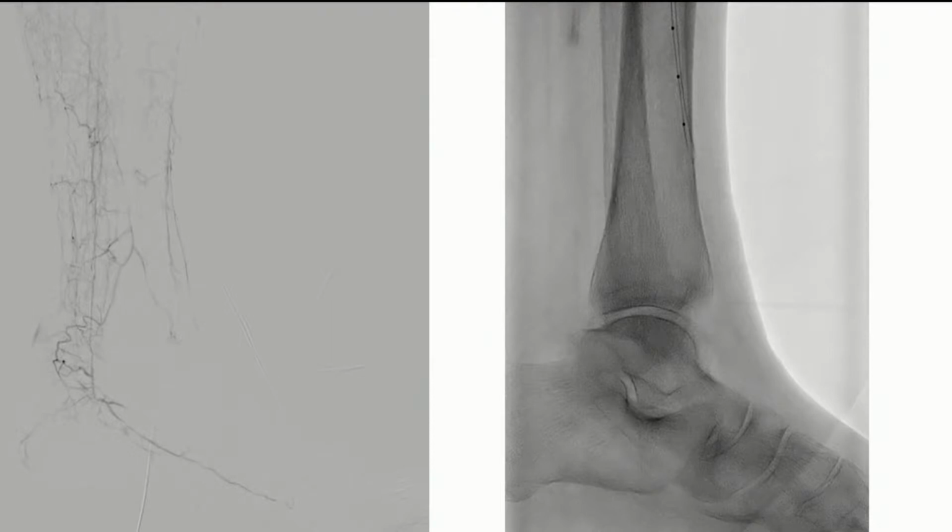This was a patient of ours who came to see us a couple of months ago. And what we're seeing on our left is an image, an X-ray technique where we basically take the bone out and we're looking at the blood vessels going into the foot. And what we're really not seeing, actually, is there's very, very poor blood flow to the leg. And this is someone who came to us, interestingly, or not so interestingly, was offered an amputation as treatment.